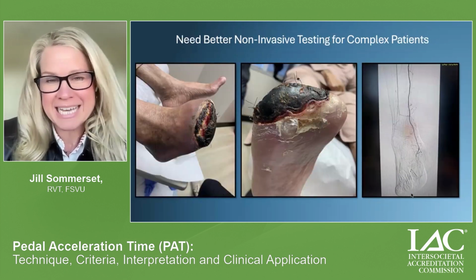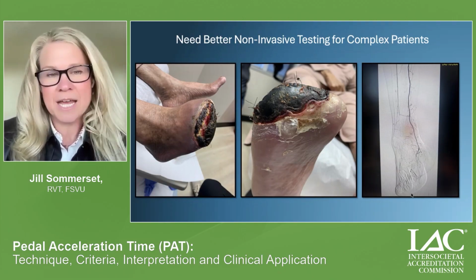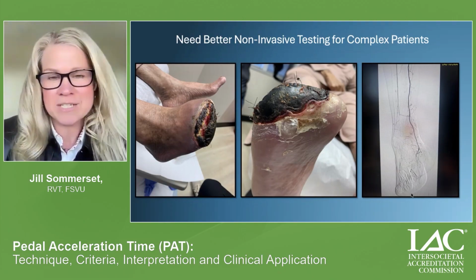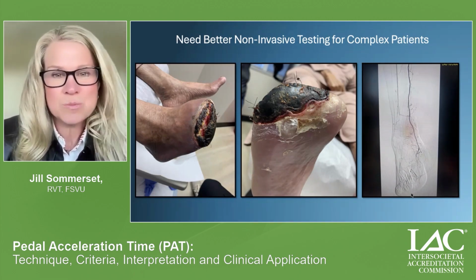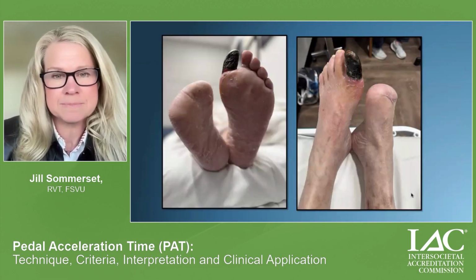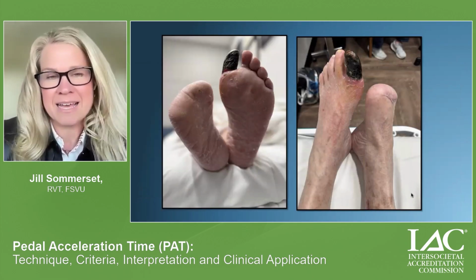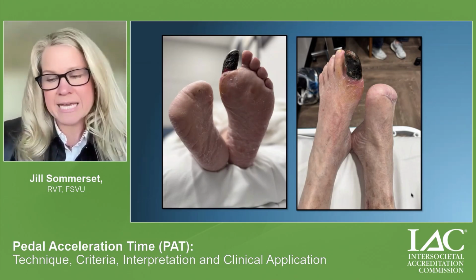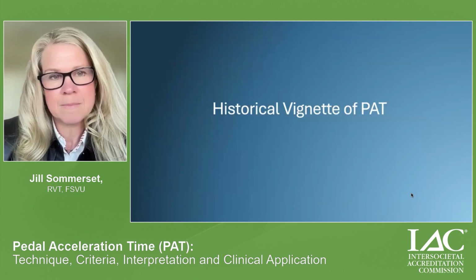Because we all have patients like this where it's really challenging. The ABI is not compressible, and now you have this non-healing wound, and we have to tell our vascular surgeon or vascular specialist, what does the flow look like to the wound bed? And that can be really challenging. And again, these are patients that we see in our daily practice that really require, I think, an advanced tool, scanning into the foot using pedal duplex ultrasound.